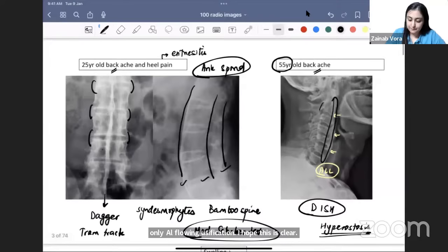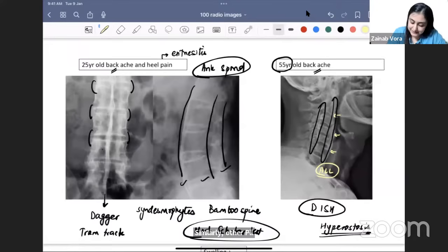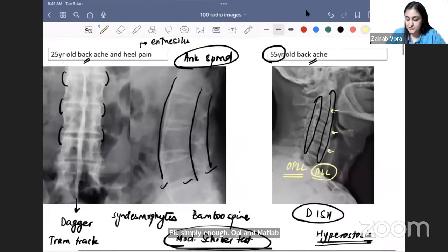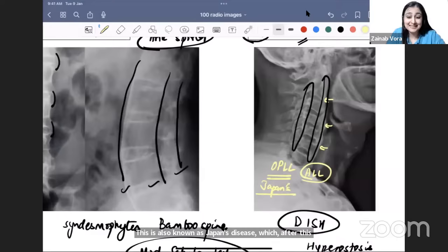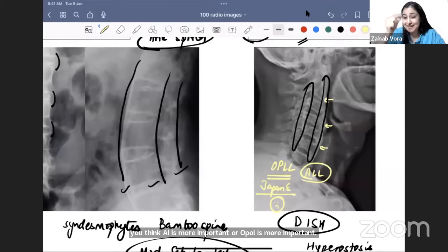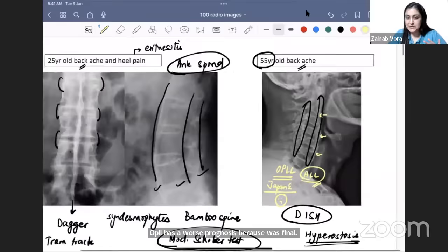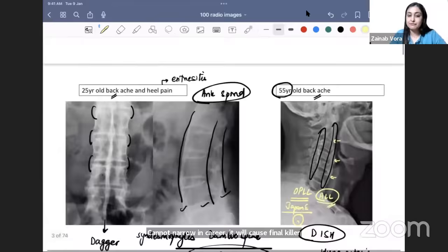Similarly, if the posterior longitudinal ligament undergoes ossification, we call it OPLL — Ossification of Posterior Longitudinal Ligament — also known as Japan's disease. OPLL has a worse prognosis than ALL ossification because it causes spinal canal narrowing, whereas ALL ossification does not cause much except pain.